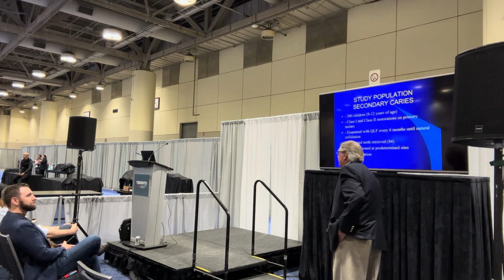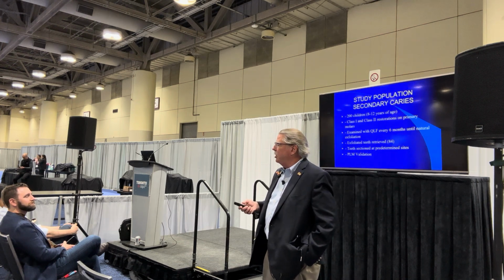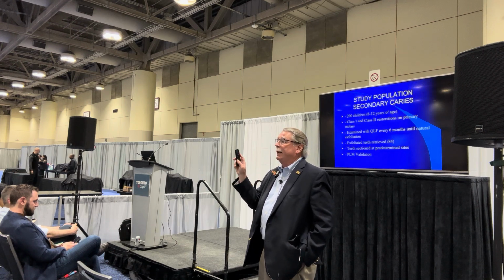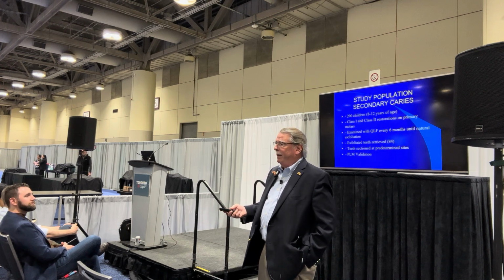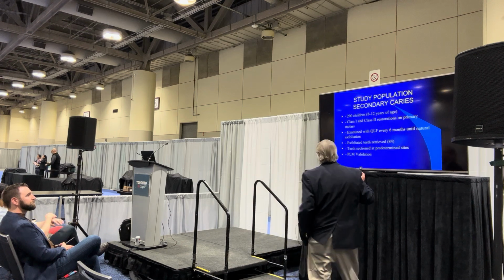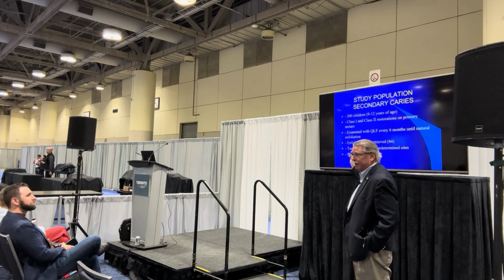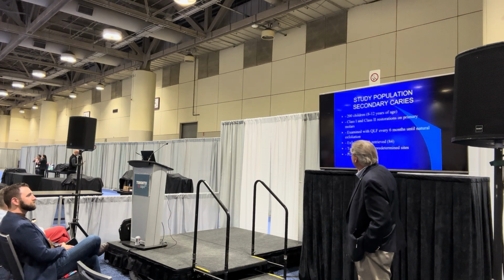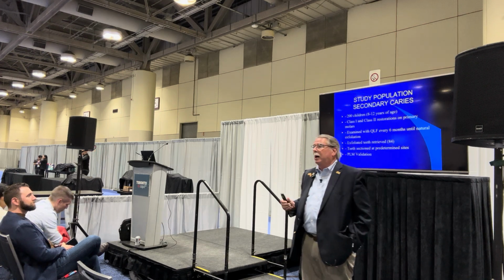And so we took it to the second phase because it was being published. I guess the biggest person was Kidd from the UK saying, you know, you're doing more restorative now, not you guys, but in general, dentistry altogether, for secondary caries now, recurrent caries. And so we didn't know if it was accurate for that. So we went back, did another phase 3, used 200 children, again 8 to 12, put class 1s and class 2s on them, followed them every 6 months until those teeth exfoliated. Again, we sectioned them and validated what we'd seen with QLF with polarized light.